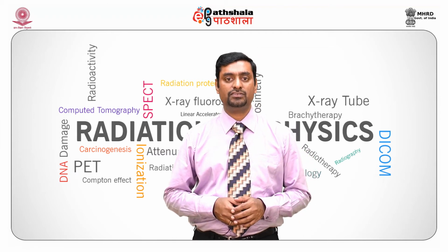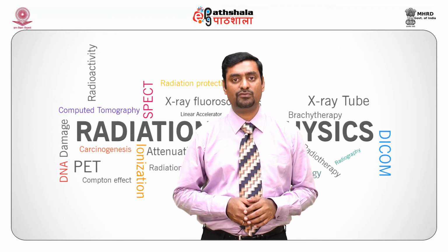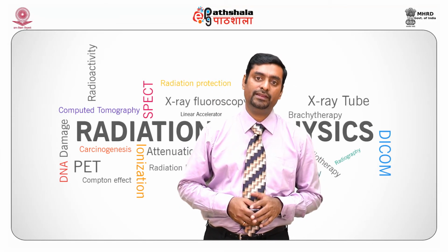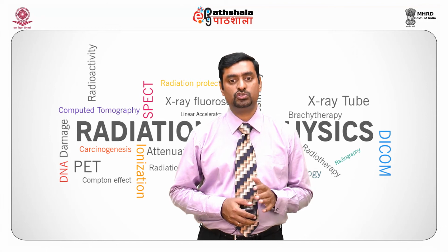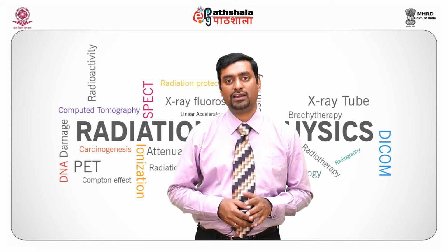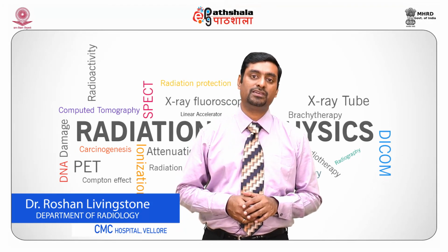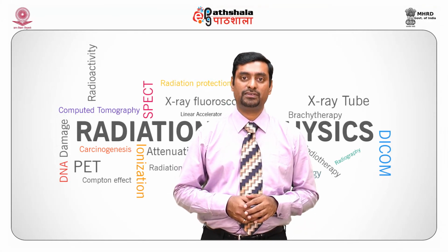The indirect flat panel detector uses a scintillator crystal and a photodiode array of amorphous silicon to convert X-rays to light and then to the electric charge to form a signal which can be viewed on a monitor. In case of a direct flat panel detector, amorphous selenium is used to convert X-rays to an electric charge. Hence, it is a direct charge. We do not have a conversion of light to electron. Hence, the digital imaging systems used for mammography these days have direct flat panel detectors, which have improved spatial resolution compared to the indirect flat panel detectors.